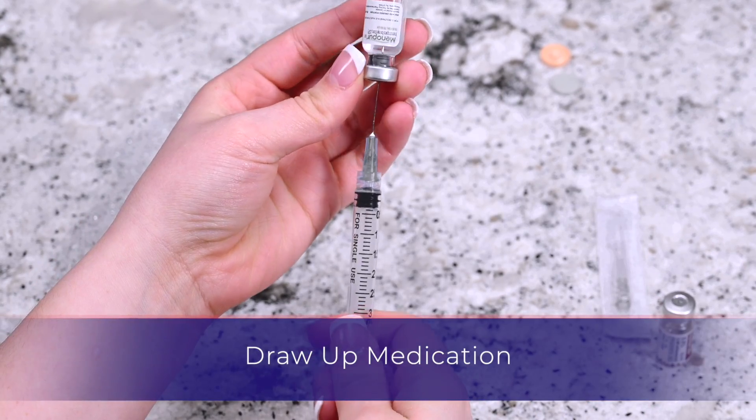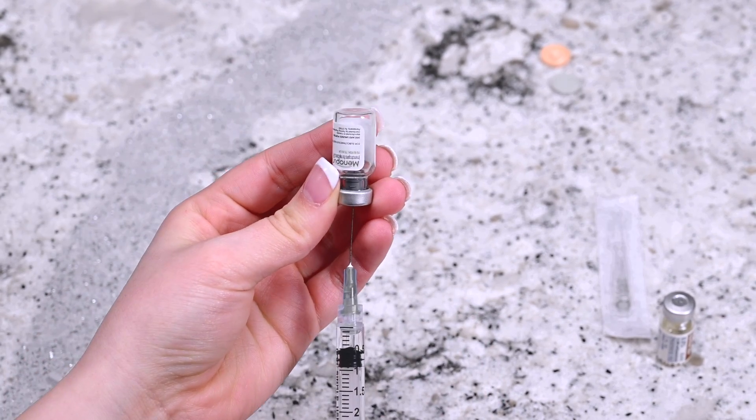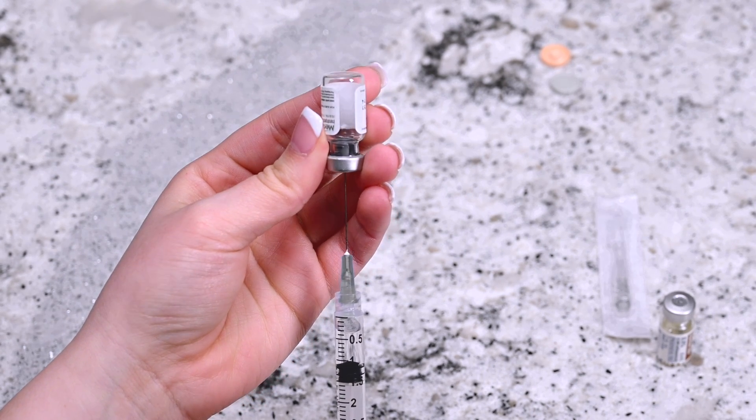Invert the syringe without removing it from the vial and pull the plunger back until all the contents from the vial transfer to the syringe. Once finished, carefully remove the needle from the vial and recap the mixing needle.